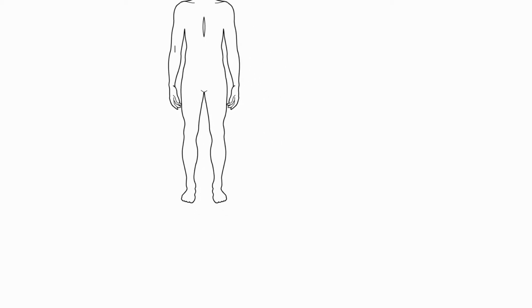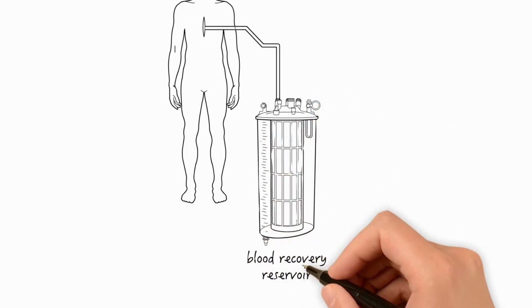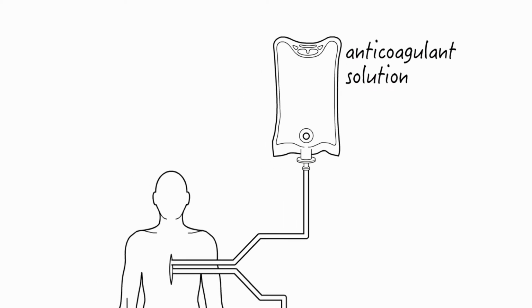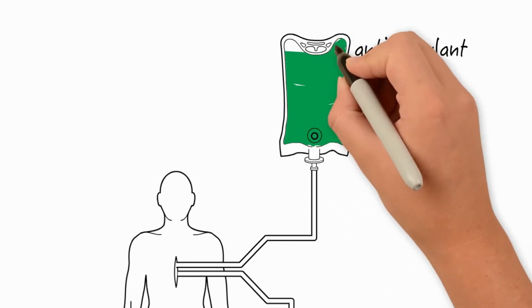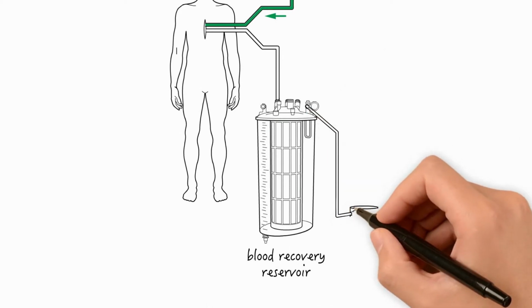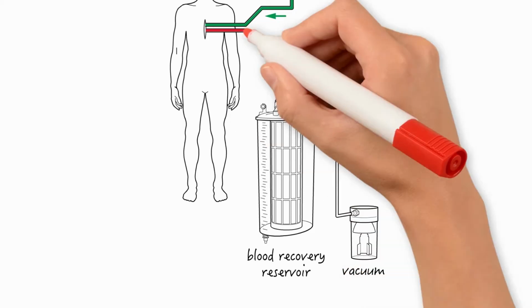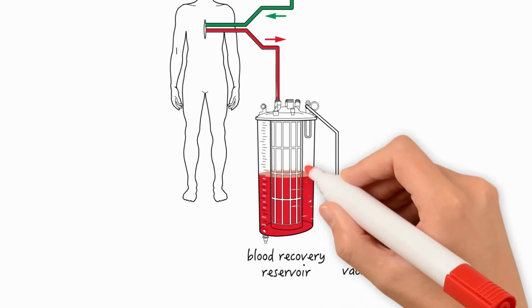The process begins by collecting the blood from the surgical wound into a sterile reservoir that contains a filter. This is accomplished by using a dual-lumen aspiration line that contains an aspiration line and also an anticoagulation line so that the blood does not clot. Vacuum is applied to the reservoir via a vacuum source, most often the Xvac. The anticoagulant joins with the blood at the point of aspiration. This avoids clotting and also reduces activation.